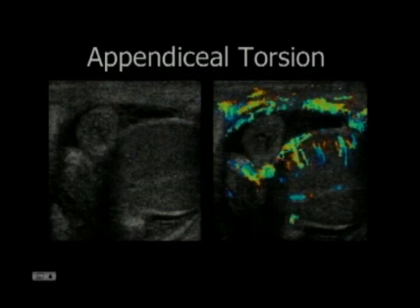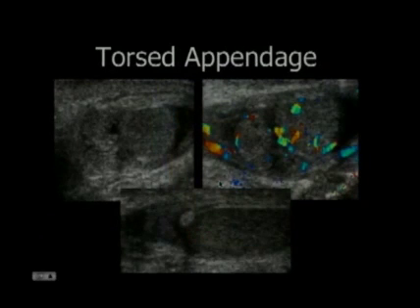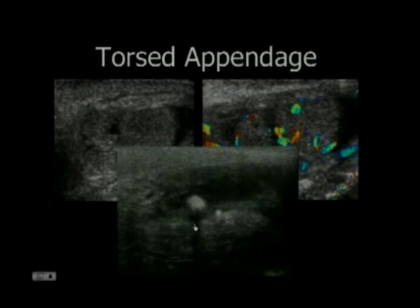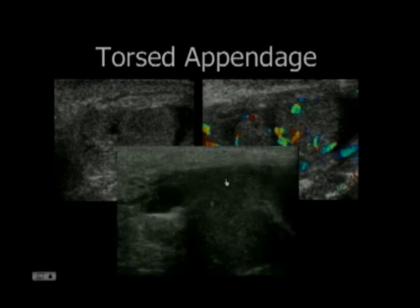Here's just another case showing this torsed infarcted appendix with tremendous hyperemia in the scrotal wall and within the testicle. Again, most of the time they don't need to be operated on, but if the pain is not going away in a week, they will operate, they will lop off the torsed appendage, causing this tremendous inflammatory reaction of the adjacent epididymis. Later, as they shrink down, they will calcify into these little nubbins that you will see on later imaging, and these can actually float free within the scrotal sac and become these scrotal mice. One of my favorite clips in the world shows one of these flinging around loosely within the scrotal sac.